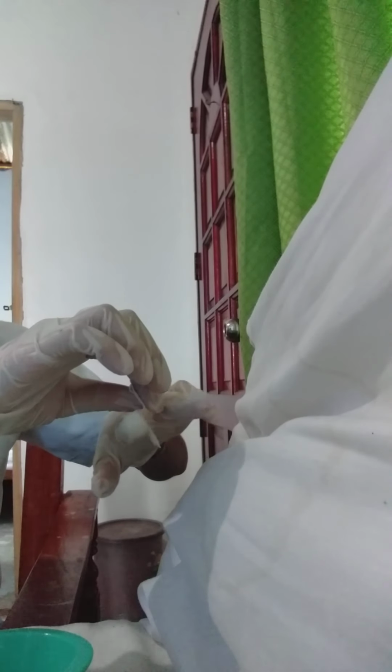And then we have to place and hold the swab between the third and fourth fingers of the non-dominant hand, and then prepare our syringe for injection.